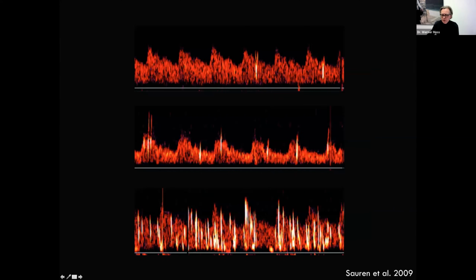And here we have another 3 examples from one of our studies. They can occur rarely, more often, or sometimes regularly. This can be so extreme that you only see white emboli, which would be called a curtain.